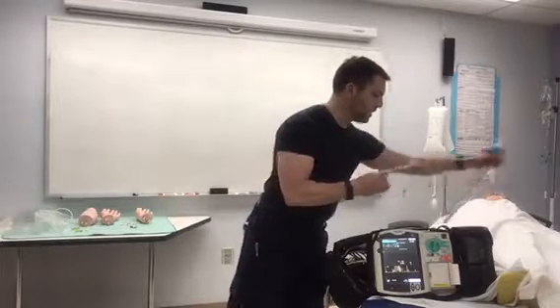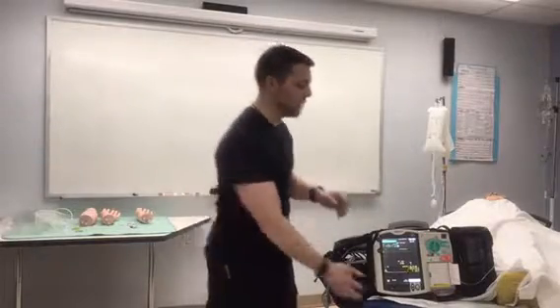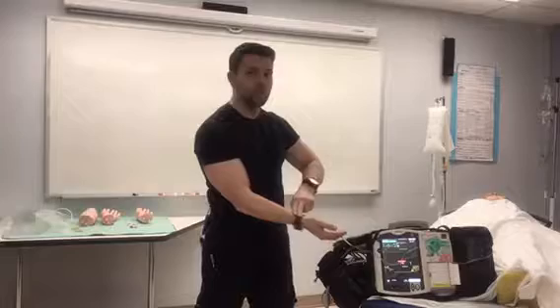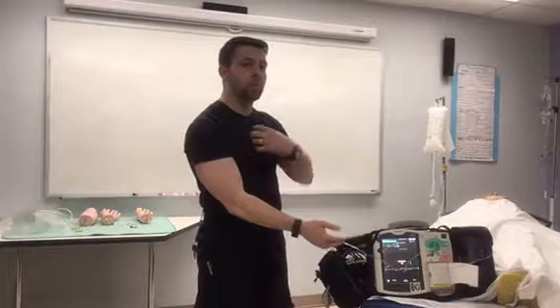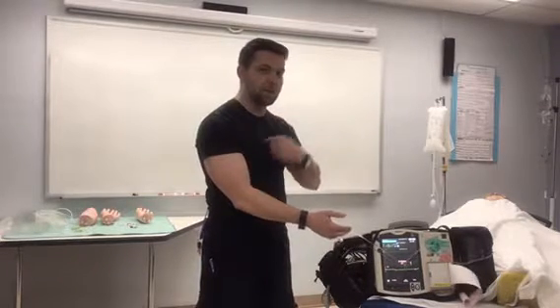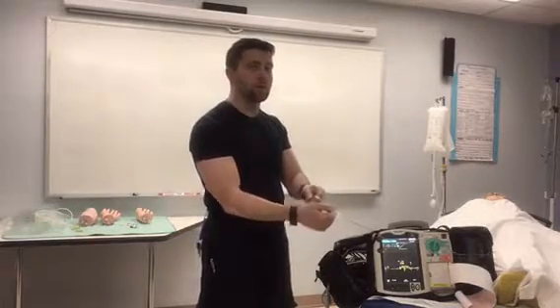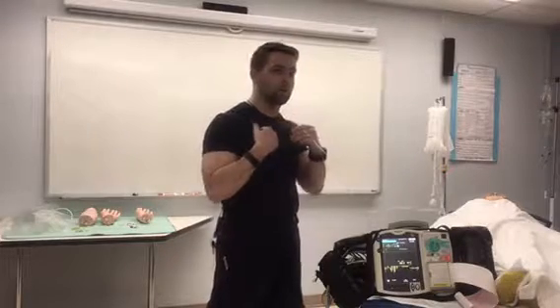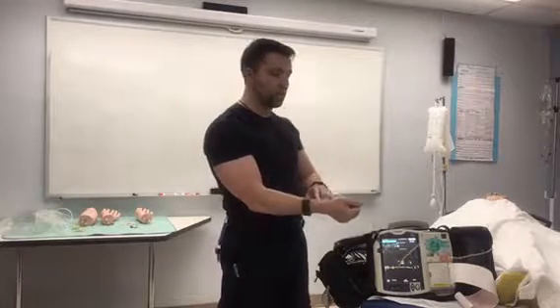The best way that I can explain this, which was taught to me, is to think about what this is doing. You put your fingers on someone's radial pulse, and what you're feeling is the pulse wave from the heart, squeeze, and then coming down, and you feel the pulse wave. Well, this is just connecting into a catheter. It can actually be a radial artery. Could be the central line, right into the right atrium. But at the radial artery for an art line, this is just an extension of the pressure wave, whether we're monitoring the venous system or the arterial system. This is just an extension of the pressure wave.